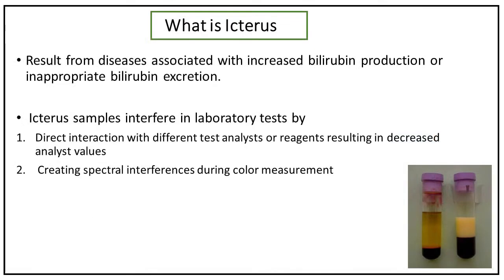What is icterus? Icterus results from diseases associated with increased bilirubin production or inappropriate bilirubin excretion. Icteric samples interfere in laboratory tests by direct interaction with different test analytes or reagents, resulting in decreased analyte values and creating spectral interference during color measurement.